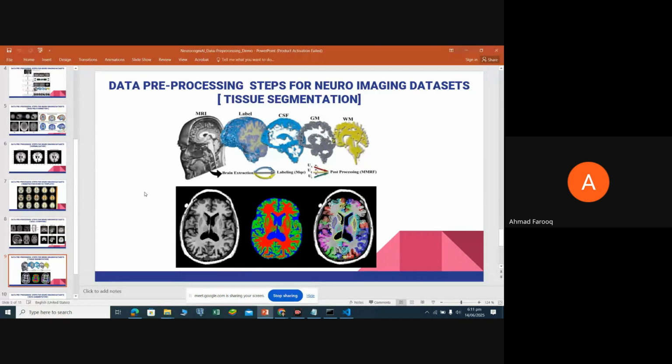Keep in mind that our system is not one that just tells the physician that the MRI you uploaded matches an MRI which has Alzheimer's, dementia, early onset of Alzheimer's, or aggressive Alzheimer's, or is not demented at all and is completely normal.